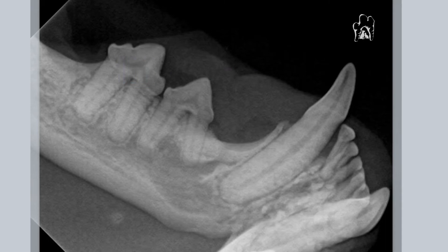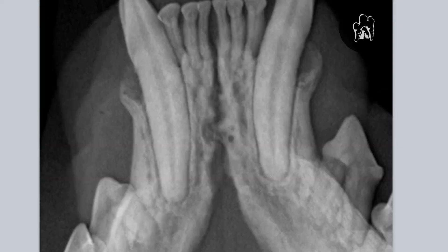Looking at it from this view, it's more expansive, and sometimes we can address that by removing some of the bone and apically positioning a flap to move the gingiva back apically to the new bone level after we've contoured that and eliminated the debris on the root.